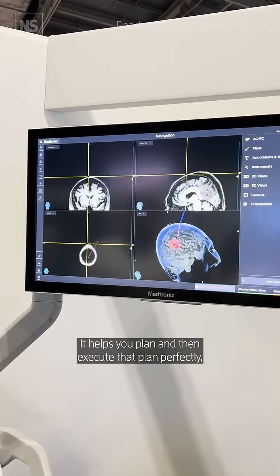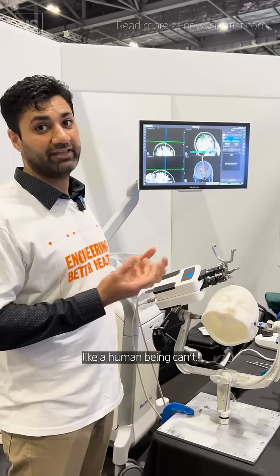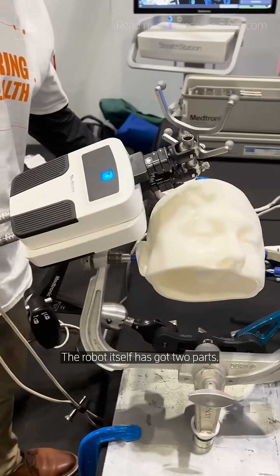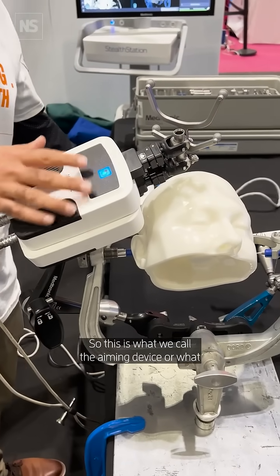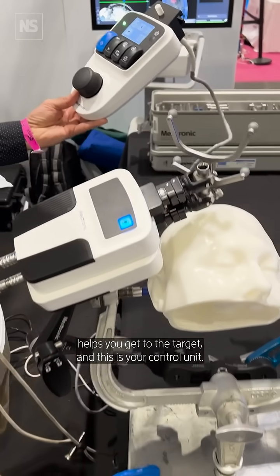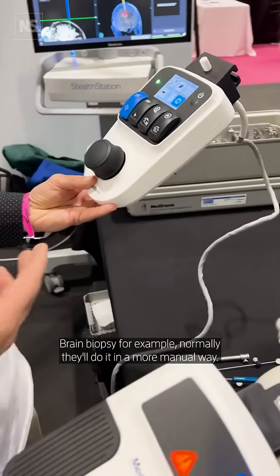It helps you plan and then execute that plan perfectly, like a human being can't. So the robot basically itself has got two parts. This is what we call the aiming device, or what helps you get to the target. And this is your control unit — for a brain biopsy, for example.